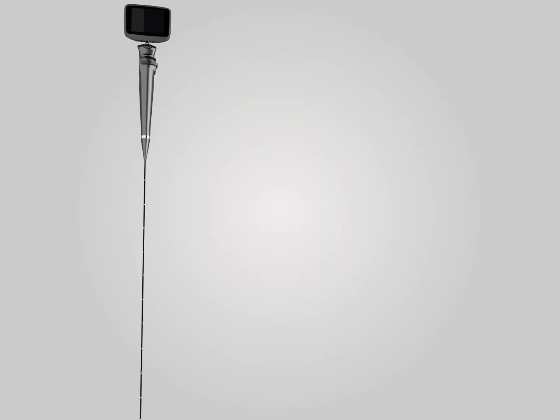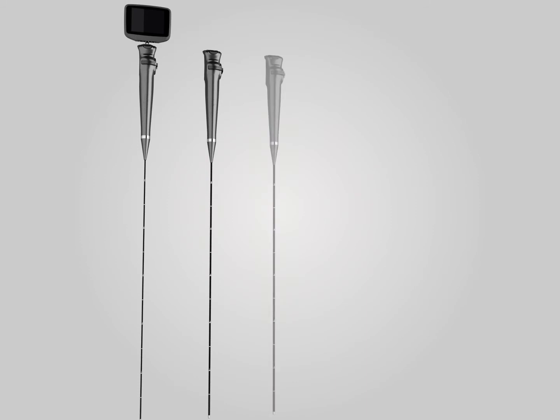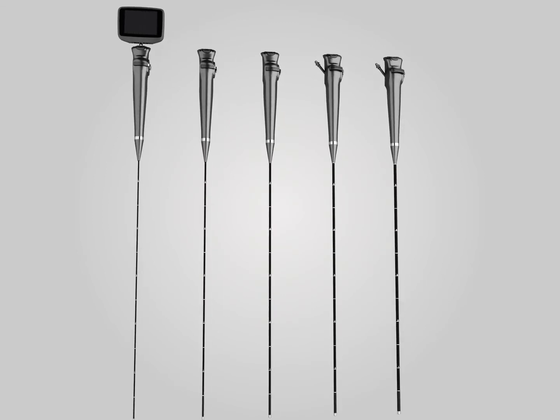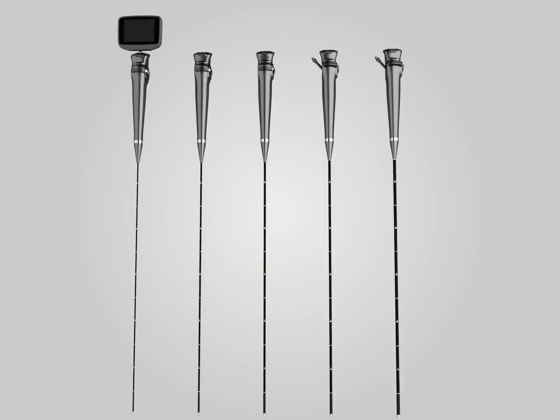The INSIGHT IS3CF Video Flexible Laryngoscope series comes in different models. Outside diameters range from 2 mm to 6 mm, and inner diameters range from 1 mm to 2.8 mm, meeting doctors' requirements across various clinical applications.